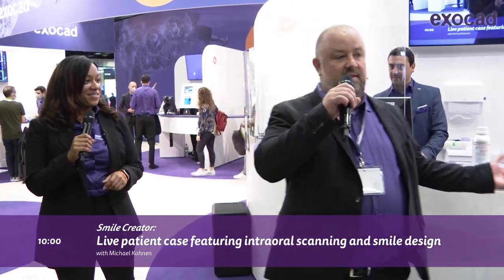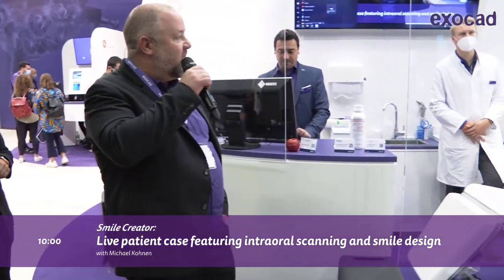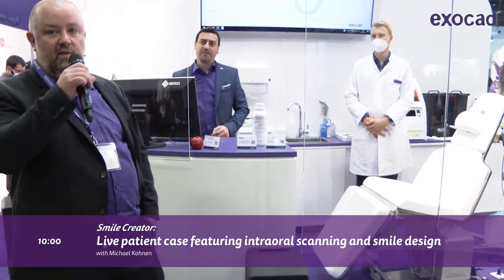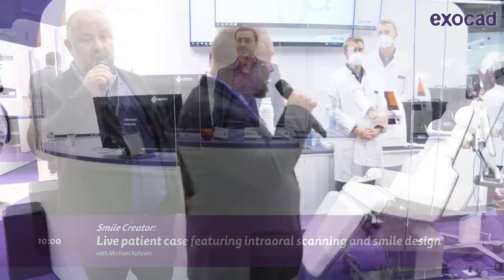The journey begins with a 2D picture, so we've made this station our challenge today. We combine 2D photography, 3D intraoral scanning, smile design, and printing in one workflow, and we try to do that in one hour.